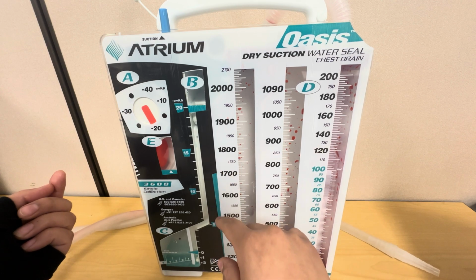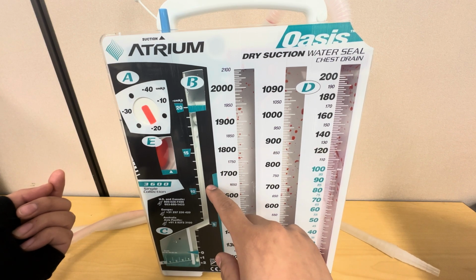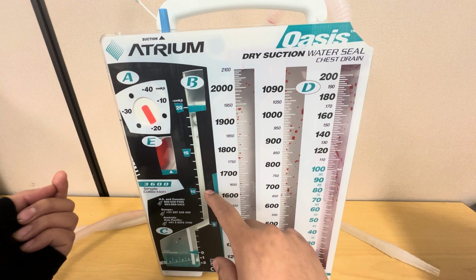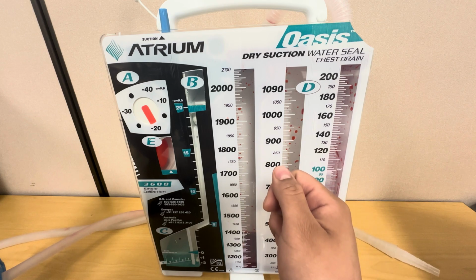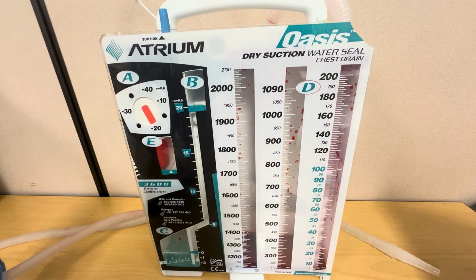So if we see that the tidaling does stop moving up and down, one of two things may have happened. Either the lung has already re-expanded to its full capacity, and in which case we would have to let the provider know so that they can come and reassess, or two is that there's either a blockage or some sort of kink in the tubing. So it's very important to then assess the tubes.